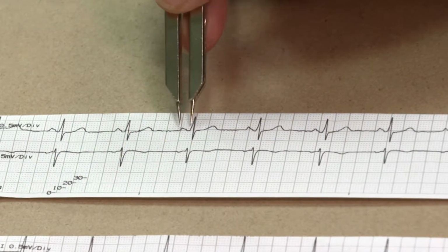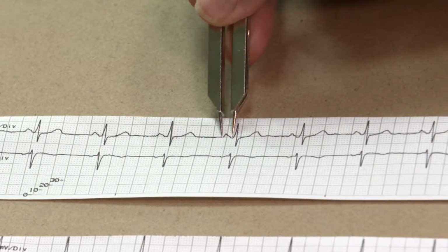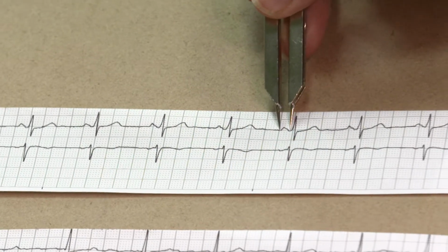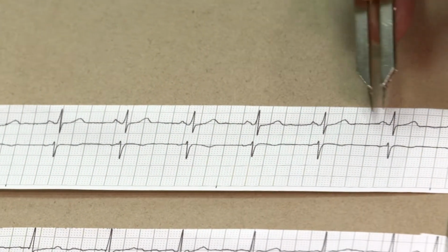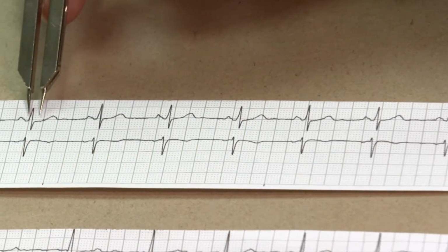So the other thing I can do is I can now map that across and see if that PR interval changes. This one is nice and consistent. So I'm happy with that. Now I can measure it.